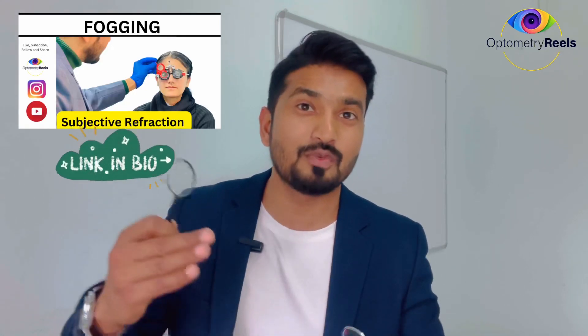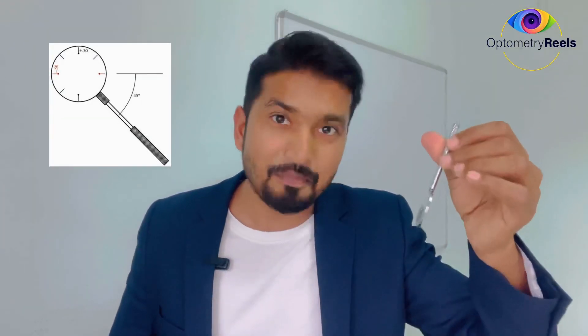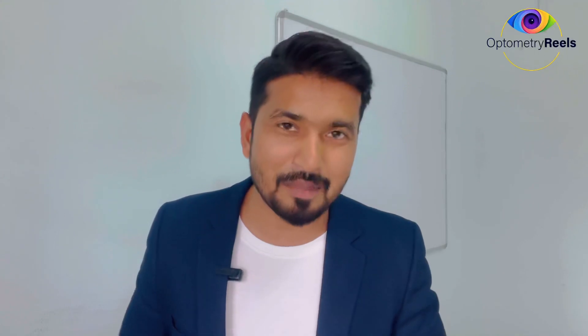So first we find out the spherical component, and then we introduce this Jackson Cross Cylinder and we flip to refine the axis and the power. I will take you to the clinic and show you step by step how it can be done on an actual patient.